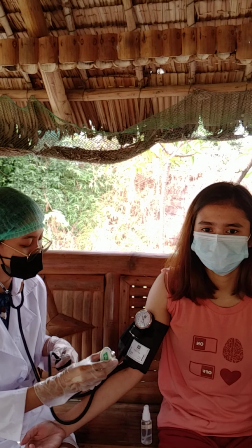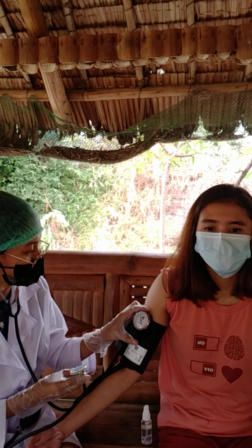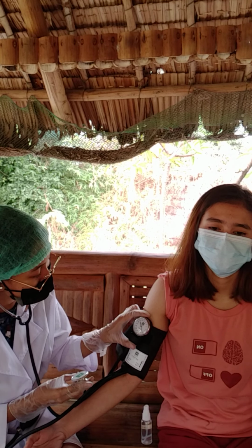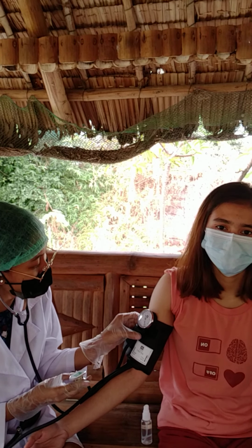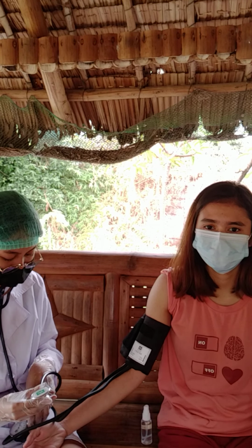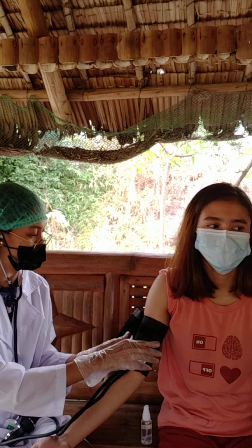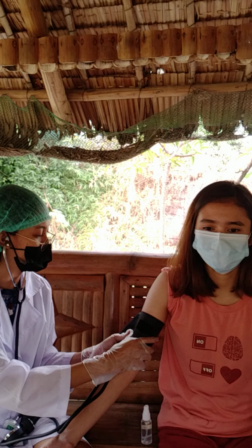So, normal naman po yung blood pressure nyo po, ma'am. 120/80. Sakto po siya sa normal blood pressure. Tanggalin na po natin, ma'am.